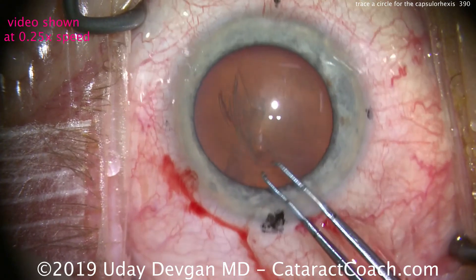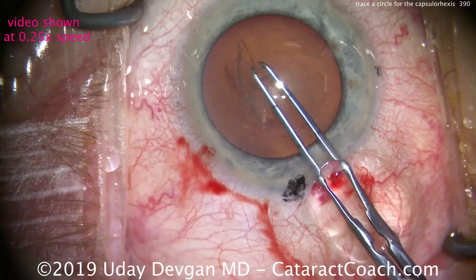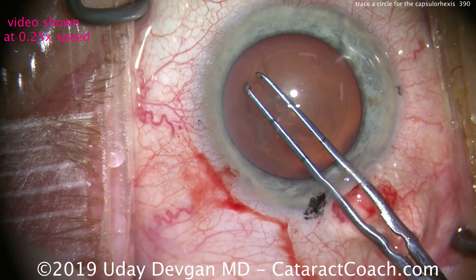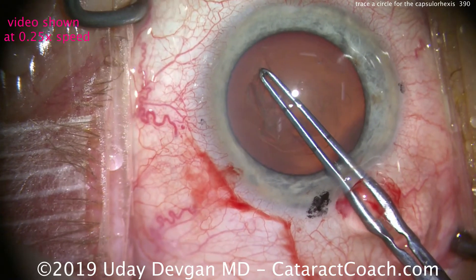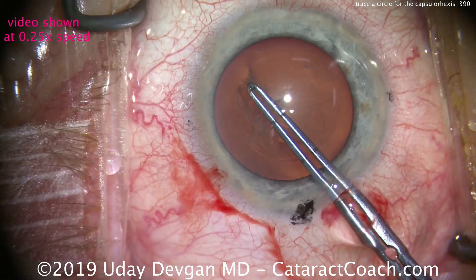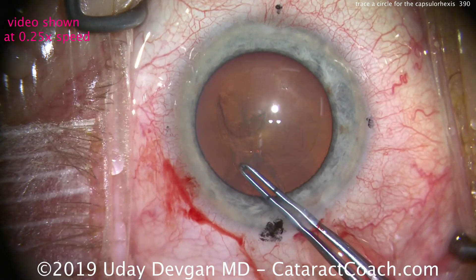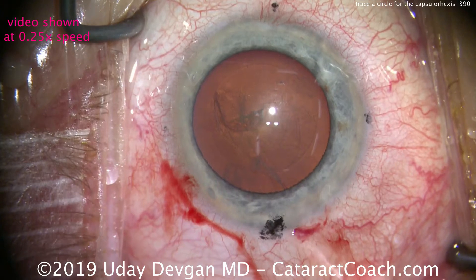We just need one last grab — going in with the forceps, grab it here, and continue that last little segment of our circle. And there we have a nice round capsular rhexis, very accurate. That's the secret as to how we do it.